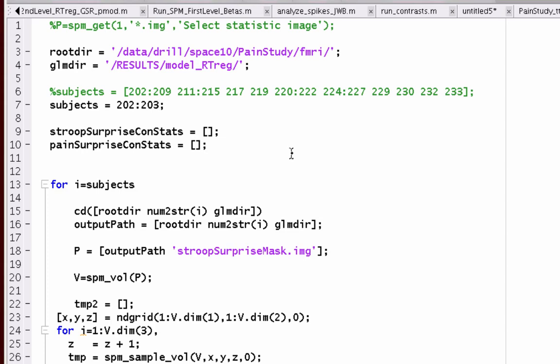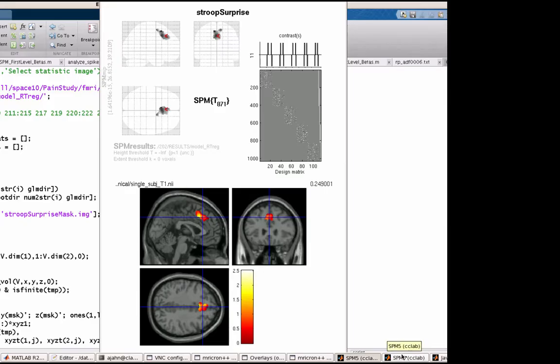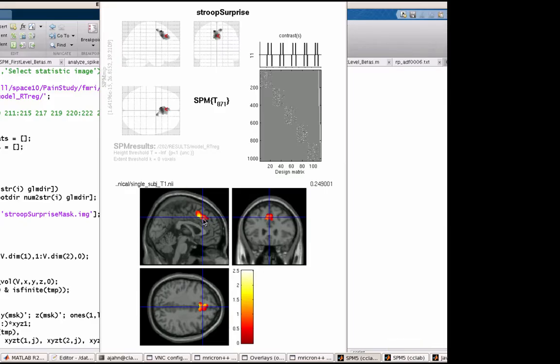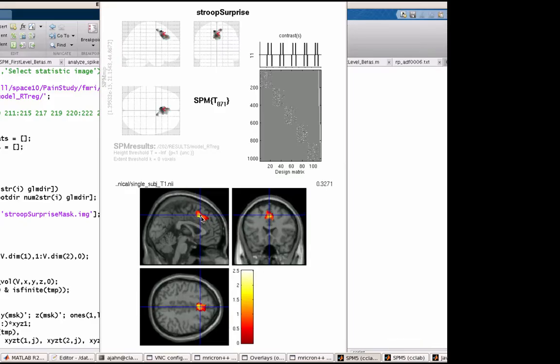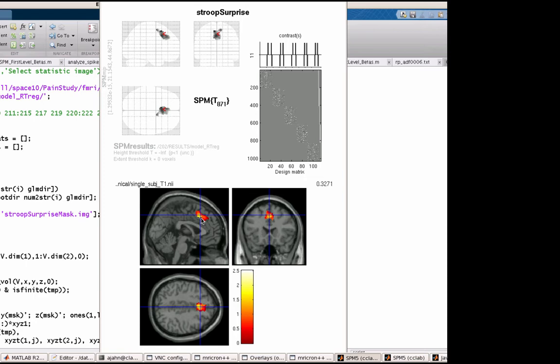In this case, on this particular example, I'm looking at surprisingly painful events and surprising stroop events, based on something you predicted. Some cue gave you some prediction and it was violated. Like the outcome was not what you expected. The probability was flipped or something like that. So what I just want to show you here is, in this case, this is the mask I'm using.